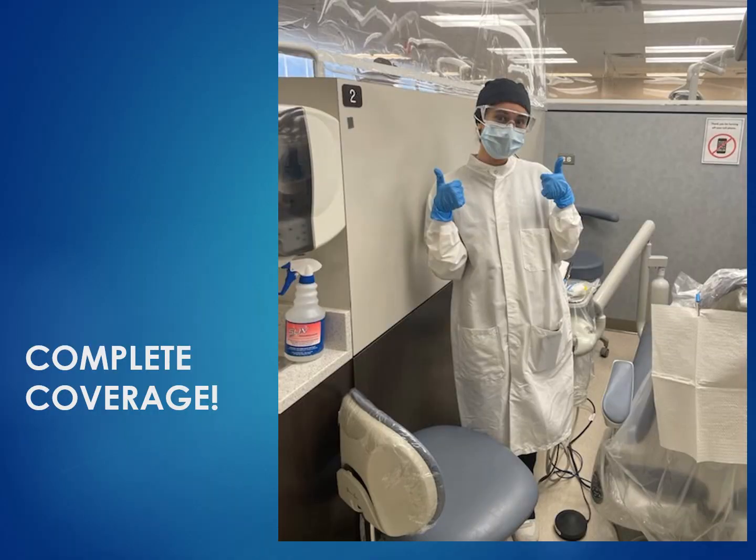This is an image of one of our recent graduates that is ready to see a patient. She has all her protective gear on, all her PPE, and then you can see the barrier on this chair. Here's one of our spray disinfectants. We have the coverage on the unit behind her. We have a barrier on the chair. There is her patient napkin ready to go. You can't see this very well down here, but there's also barriers on these controls on the sides of the chair.